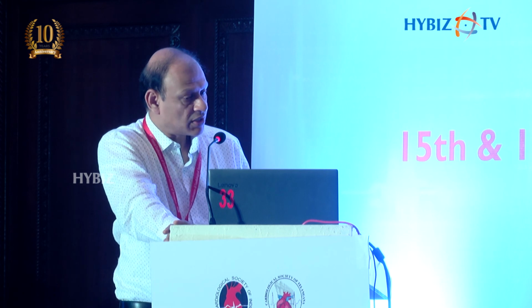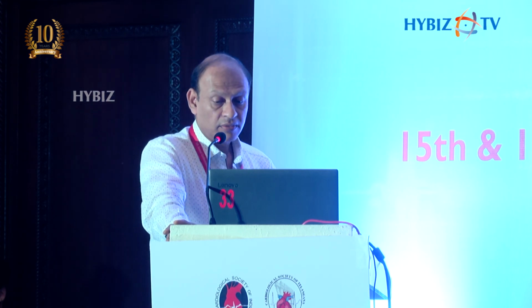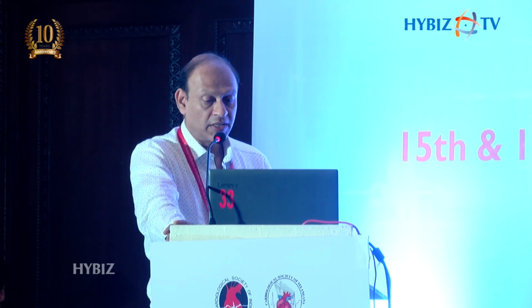If you look at the various images, there's a red thrombus there. There's a plaque rupture. There are recanalized multiple small lumens there, and there was a false lumen and a true lumen, a significant plaque rupture. This vessel had to be stented, and we had an extremely good result.